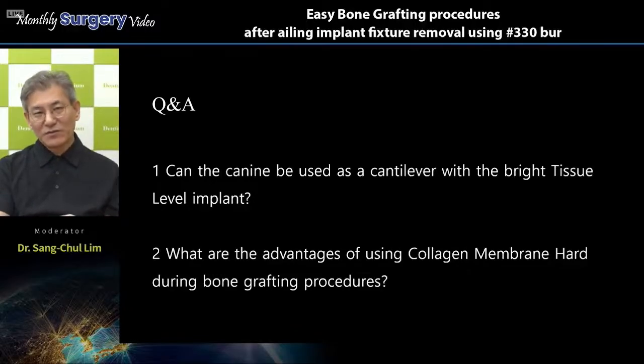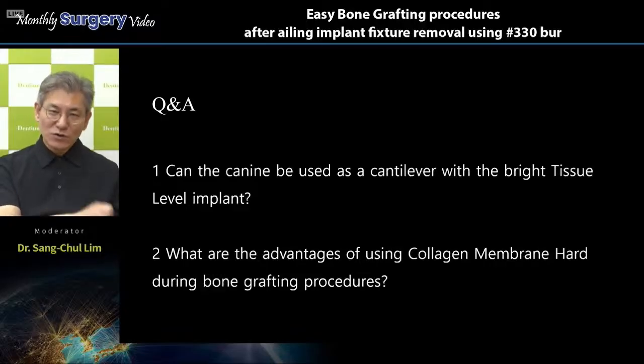However, the softer and resilient collagen membrane is suitable for small defects. And also, you can use a technique like the sausage technique with this resilient collagen membrane.